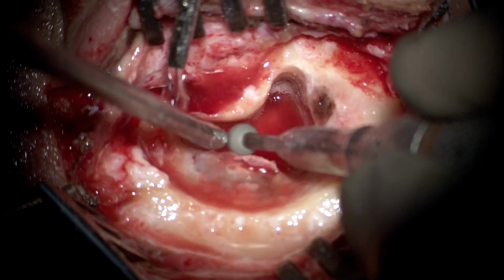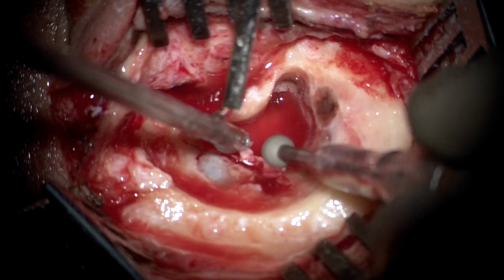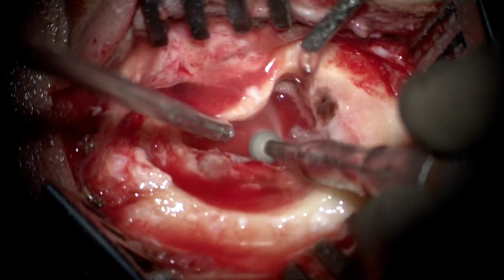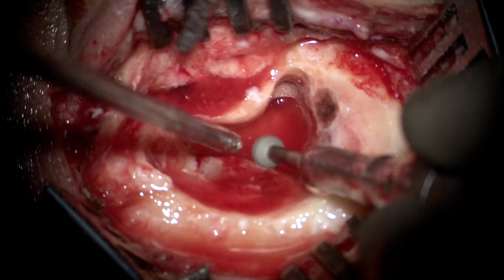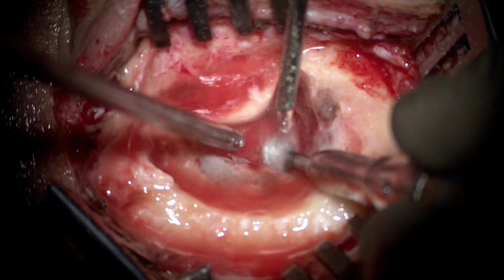Now one can see how much bone we have suddenly got clear for our drilling, and we would resume our large diamond burr to be used over this bone to achieve more exposure posteriorly. This step is not possible till we unroof the sigmoid sinus.